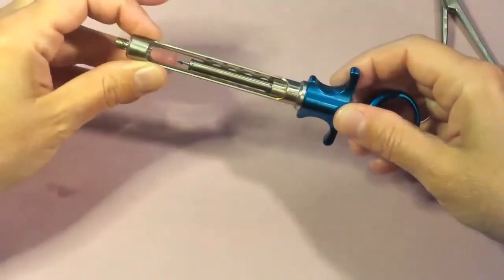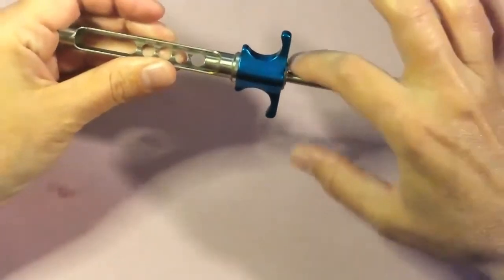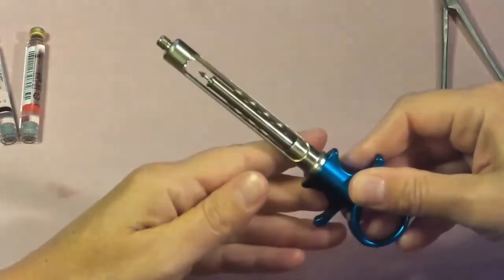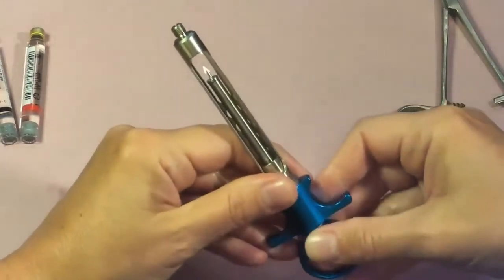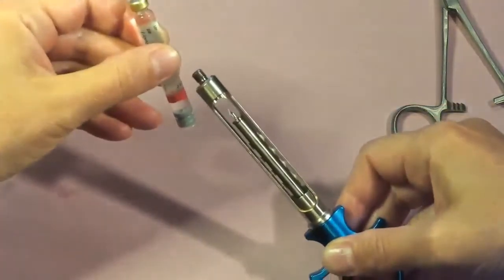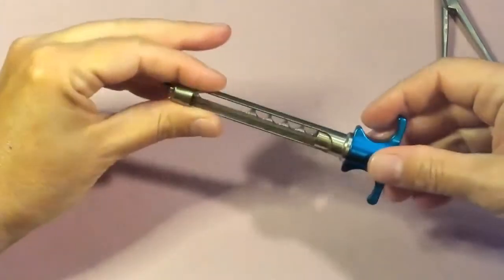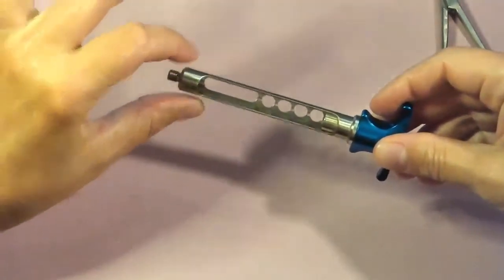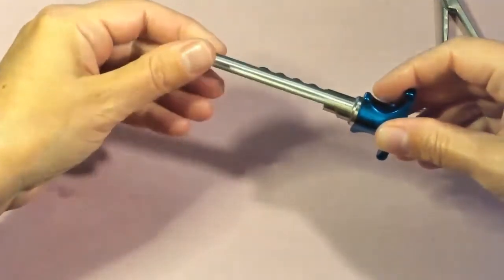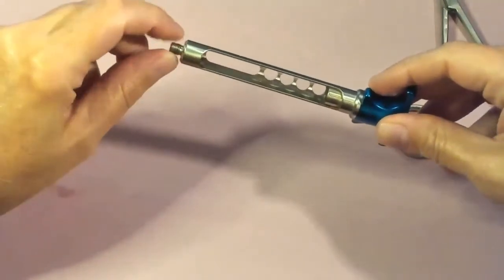There are several components to the syringe. We have the thumb ring, and this long metal piece that slides is called the piston. At the end of the piston, that sharp pointy item is called the harpoon — the piece that penetrates through the rubber stopper end of the anesthetic cartridge so we can dispense the anesthetic. This piece is called the barrel, and we have two windows on the barrel: a large window and, on the other side, a small window.